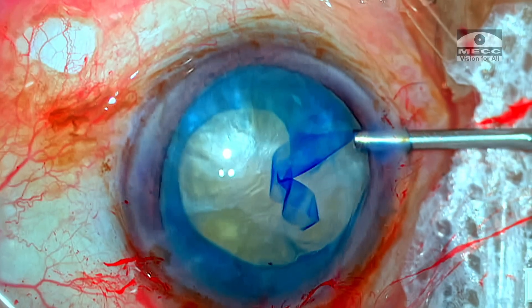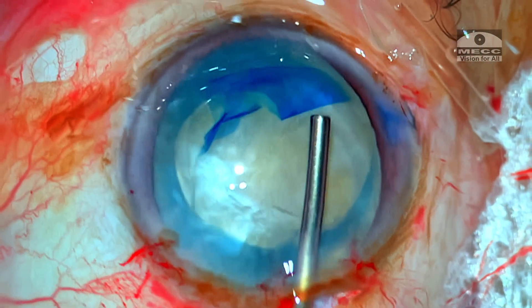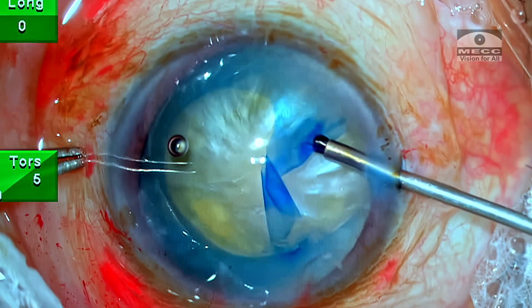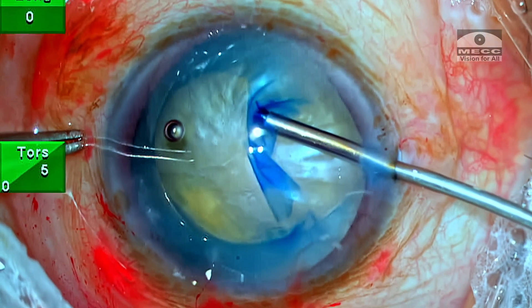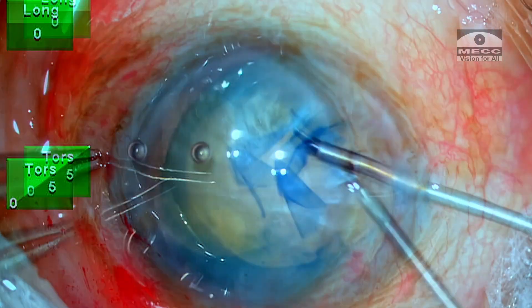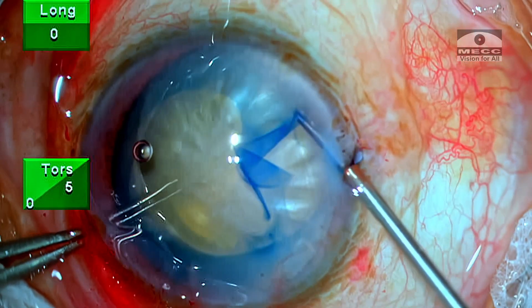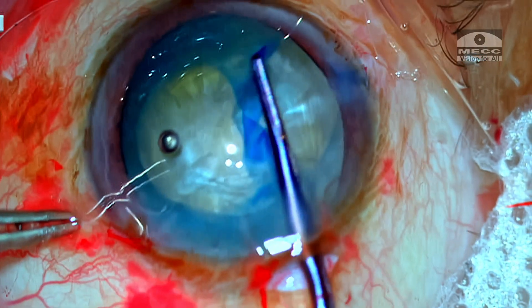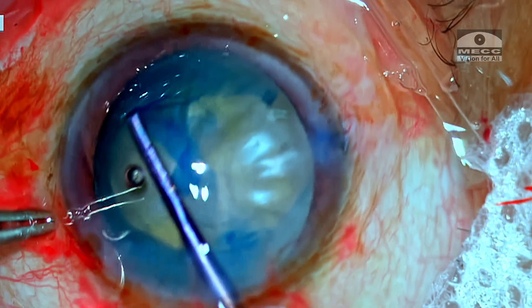This is the first case, and with experience one can always learn. But my argument is that before you venture into your first intraocular lens, or when you're exposed to a rhexis which is at risk of running away, the concept and the principles should be crystal clear. You should be ready when you encounter your first rhexis runaway.